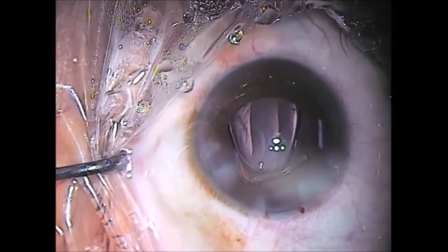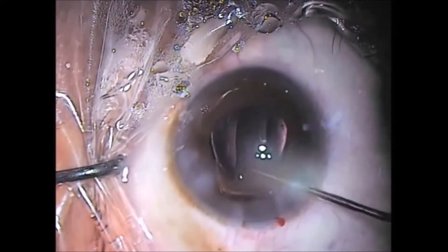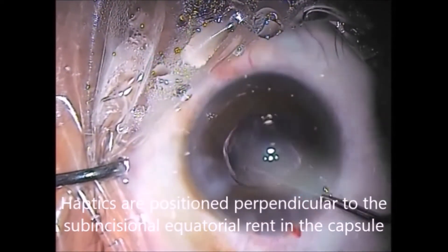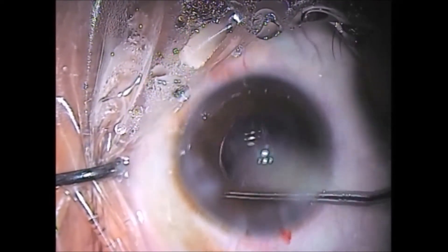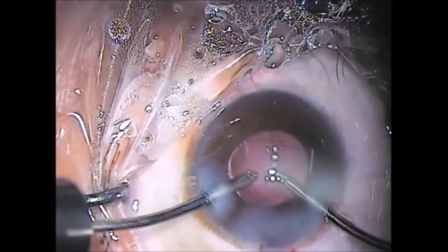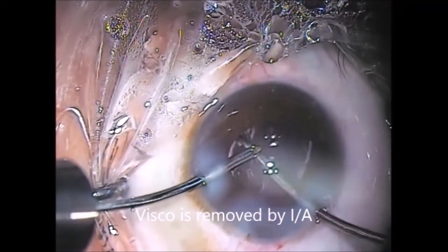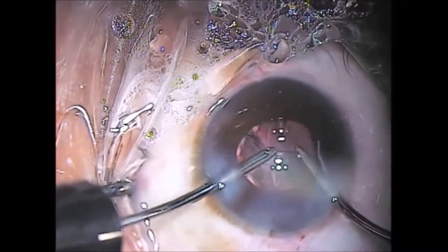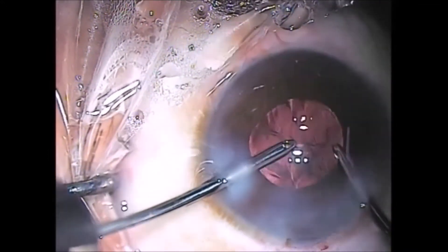A hydrophobic acrylic lens is implanted. The haptics are rotated perpendicular to the equatorial rent in the capsule. Viscoelastic is removed by bimanual irrigation and aspiration.